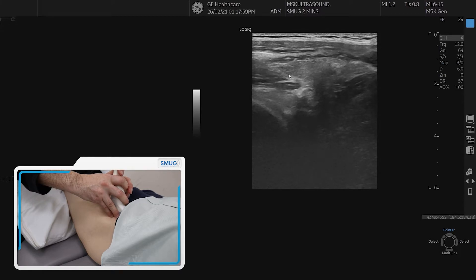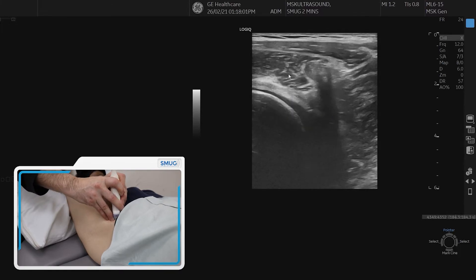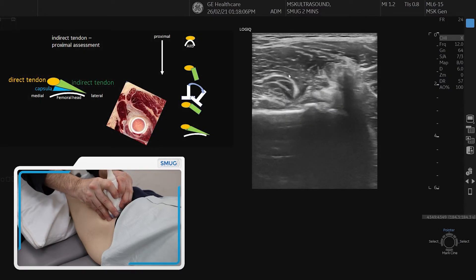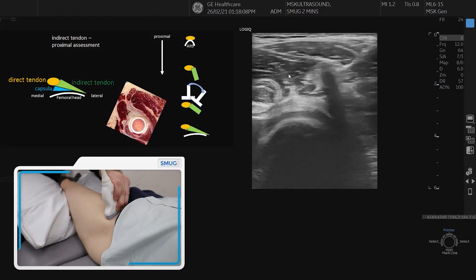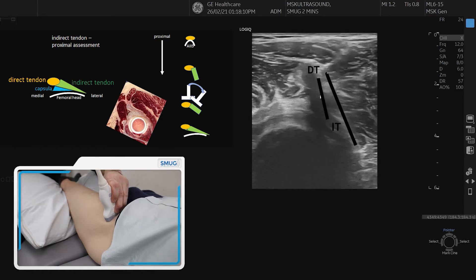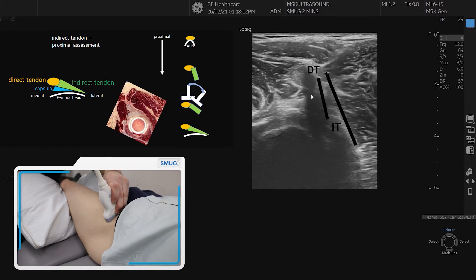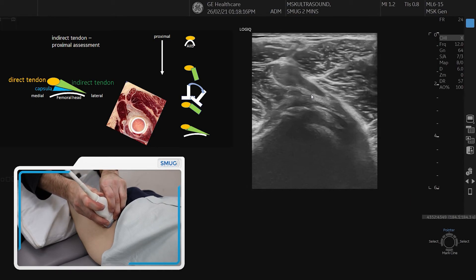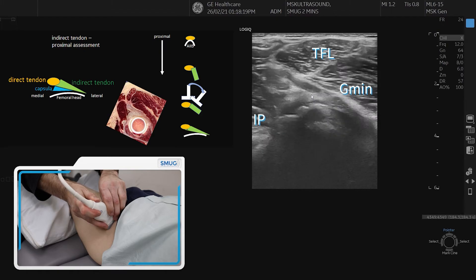So that is the direct tendon of the rectus femoris. We go back in cross-section, and now from the attachment we go slightly distal. As soon as you come off the bone, you start seeing this dark reflection — and that's the indirect tendon of the rectus femoris. To line it up, press the probe a little bit more lateral to flatten that out.